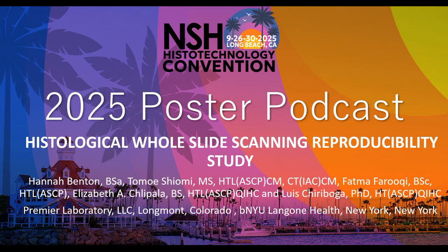And then we went through and wrote a very detailed work instruction, so each institution was following the same protocol for how they were scanning this slide, how they managed that slide, how they took care of that slide, to hopefully decrease any variability associated with the process itself. So hopefully we'll be presenting that next year as a poster.